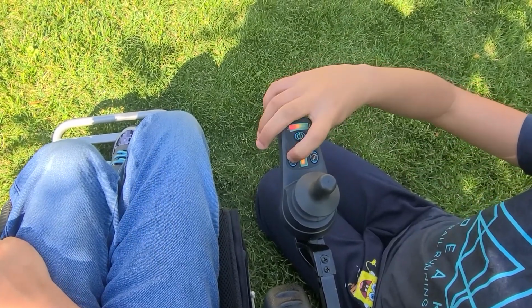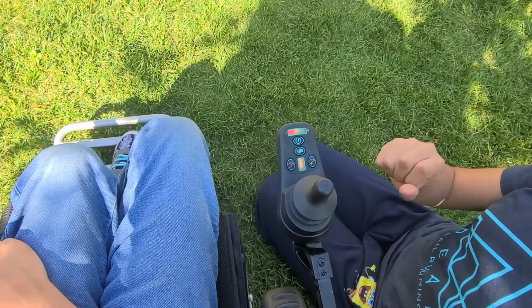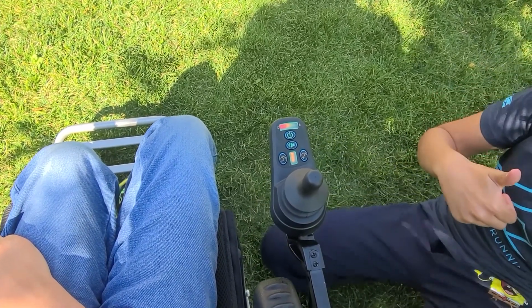There are slow, medium, and fast. Here is the joystick that moves the wheelchair around. It goes 360 degrees.